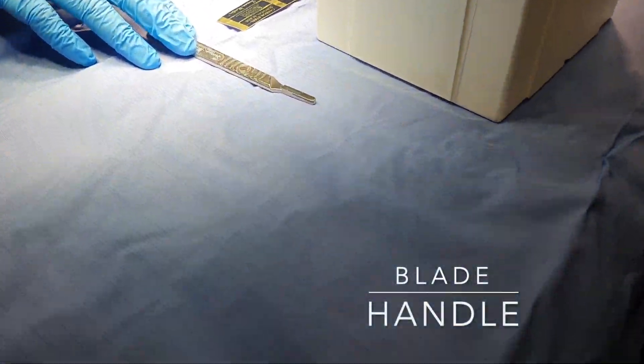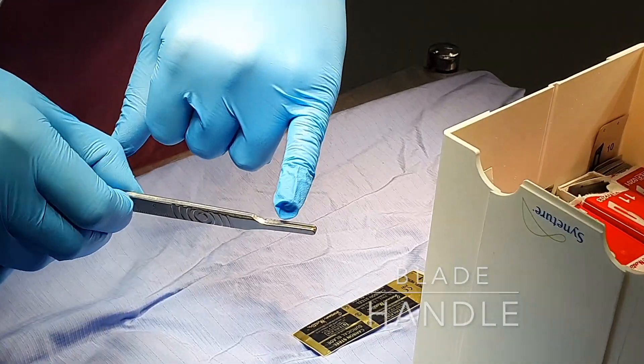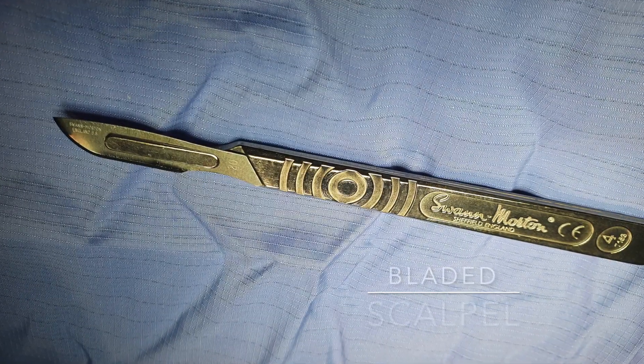Here we have the scalpel blade handle — that's the groove on which the blade slides on. This is what it looks like after the blade is attached.